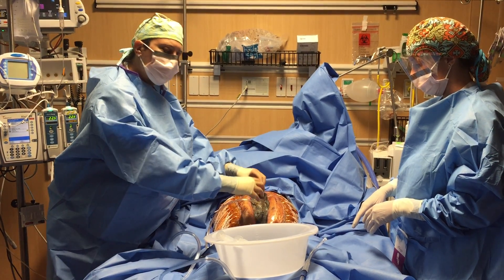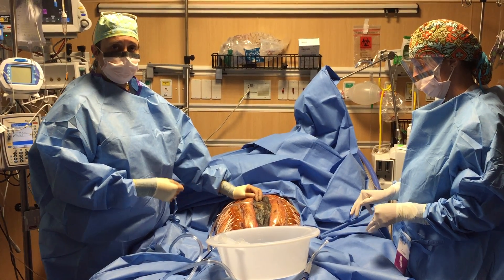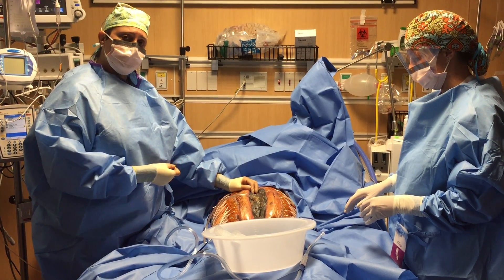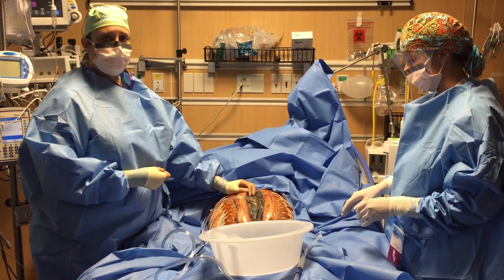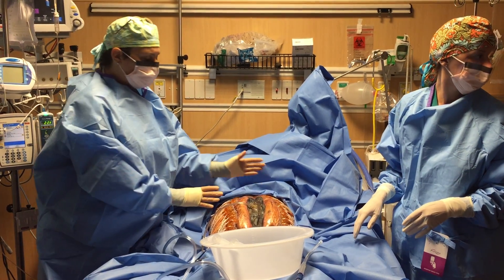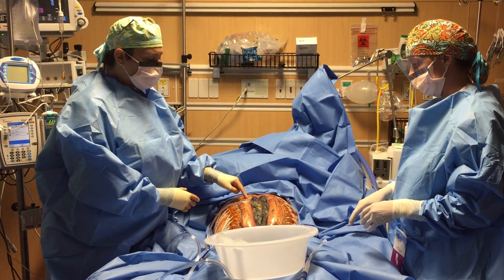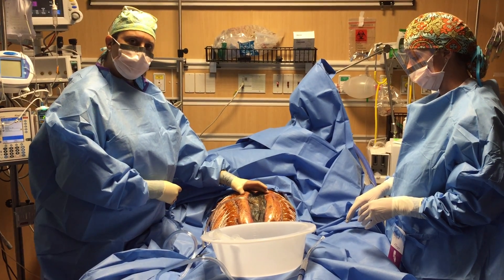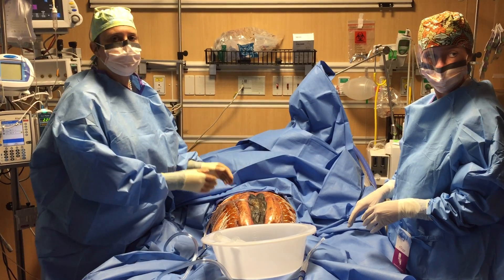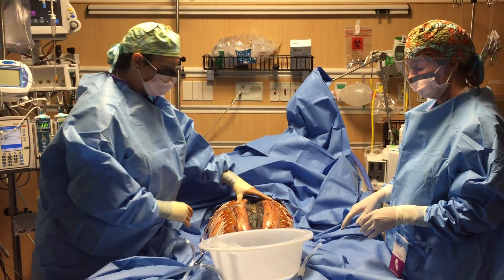Sometimes it looks like the tension is already where it needs to be. I want to make the distinction between adjusting elastomers and tightening elastomers — you adjust them, you don't tighten them. The reason is more semantics, but 'tighten' tends to indicate a static stretch, whereas this is a dynamic process. As you can see, even during the patient's respiratory cycles, this is moving as the patient breathes, which is what you want. That is part of why this is such a wonderful process and why it works so well.